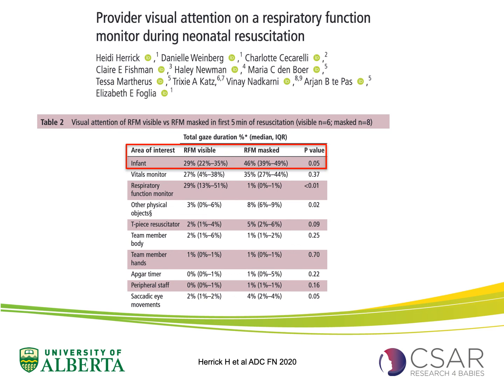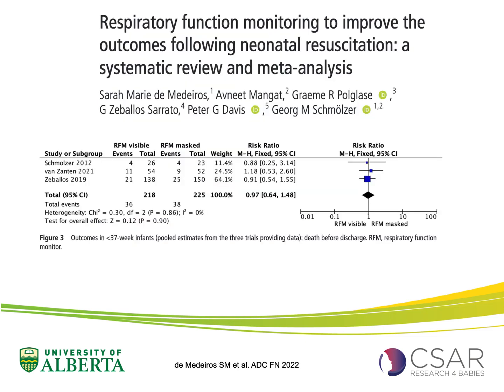So certainly it increased the amount of time people were focusing on the baby when there was no RFM present, which I think is an important outcome, because one of the most important things is to really look at the baby to assess what's going on, and maybe have a team leader who could feed back all this information from these monitors.